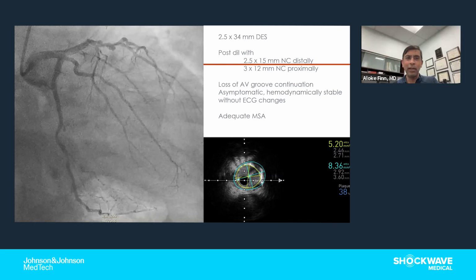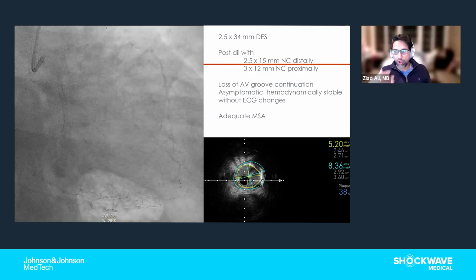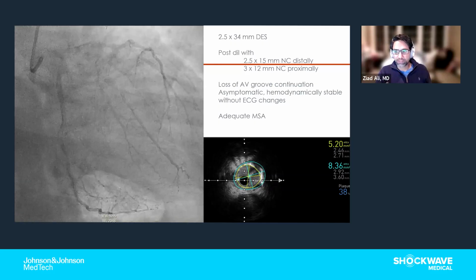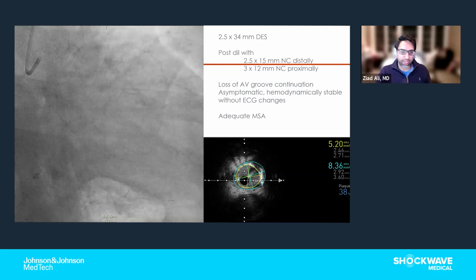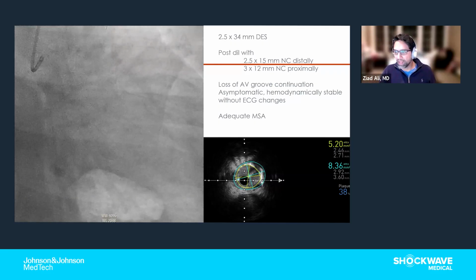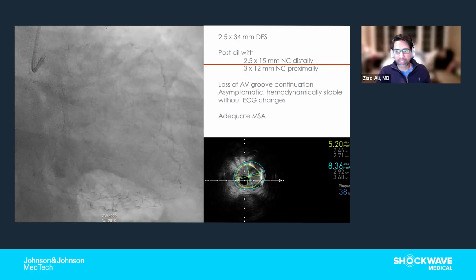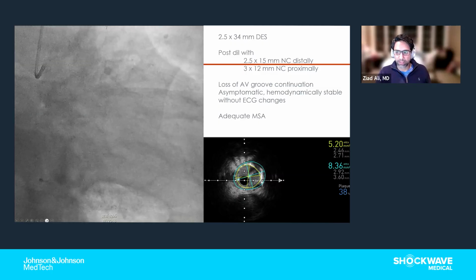Yeah. I think that's one of the other advantages. You don't have to prolong the case in these sick patients. Last remaining vessel, the case is faster. You don't have to bring in gas tanks. There's none of that sort of stuff. So the case actually has a momentum to it. And the momentum, I think, is very, very important in terms of minimizing complications.